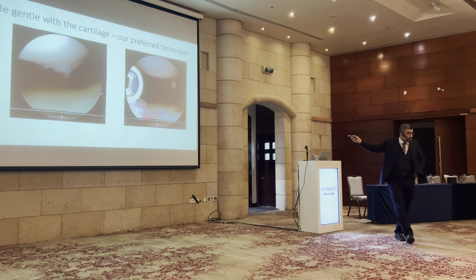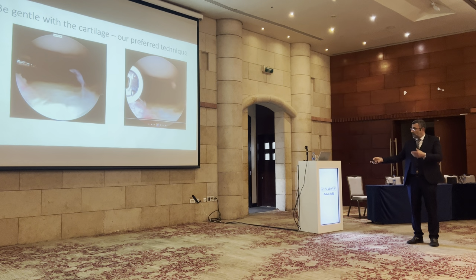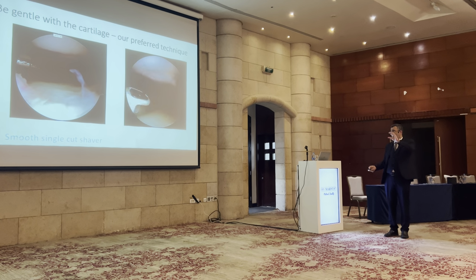Here is the patient of root tear. Here, look, this is what a colleague of us did. Look here at the lesion. We use the single cut, smooth shaver, and we are very gentle, very superficial with the cartilage. And when we use the probe, we don't touch the cartilage, just thermal shrinkage. Look here, just look at the shrinkage of the frayed cartilage. Just shrinkage without touching the cartilage.